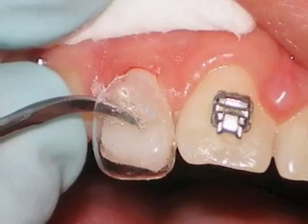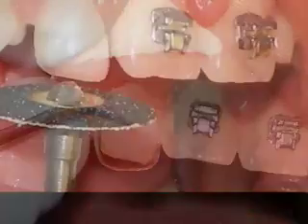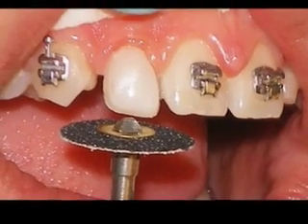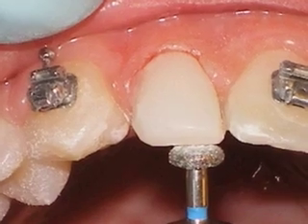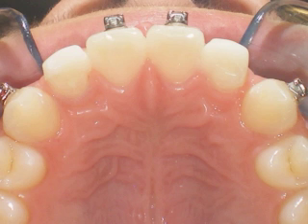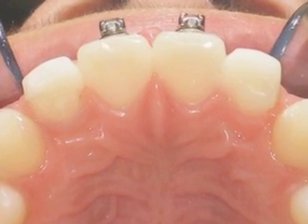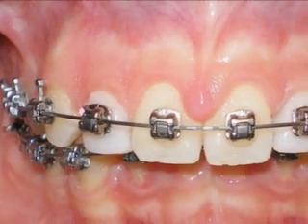The plastic face-o-form is easily removed by catching it at the gingival margin with a scaler and peeling it away toward the incisal. We can now start the final reshaping of the veneer using a sandpaper disc and donut-shaped diamond, or whatever your favorites are. We end up with perfectly shaped and sized veneers to which we can place brackets and continue treatment. The occlusal view shows the composite veneers lapping over onto the lingual surface.